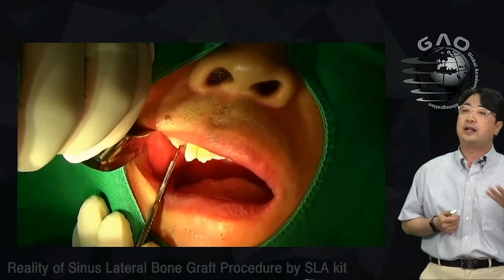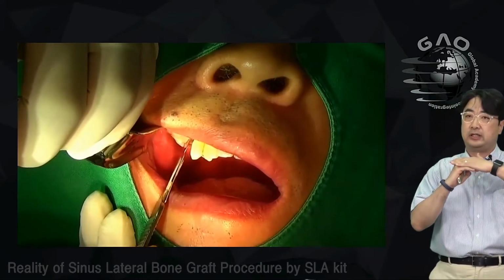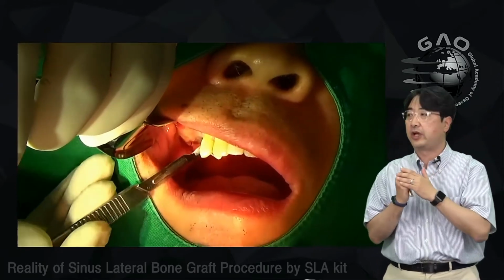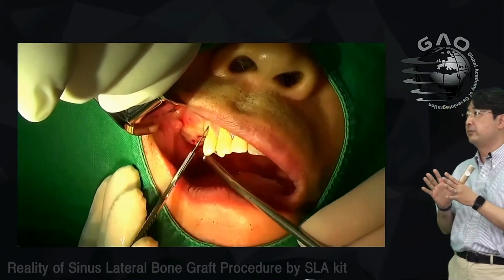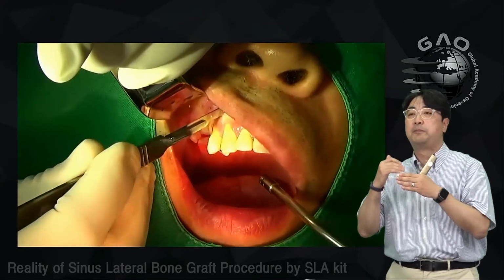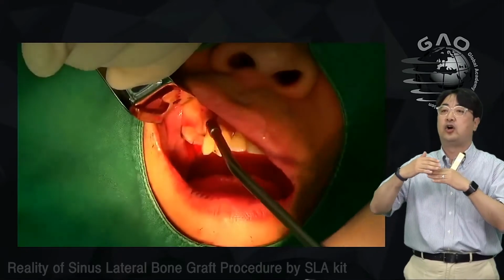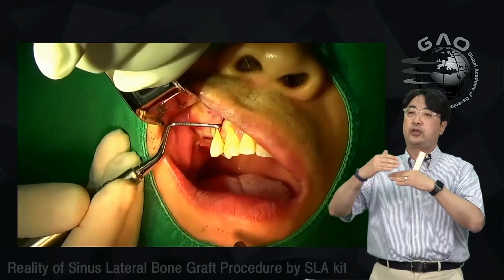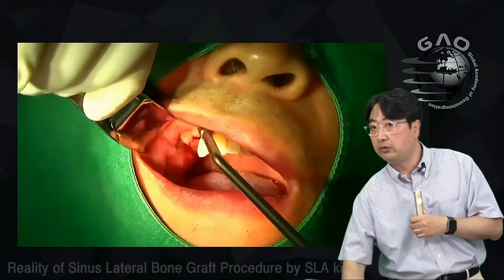My colleague didn't put anything between the maxillary sinus opening and the maxillary sinus membrane. So it means the periosteum and the sinus membrane are sticking together. So you have to dissect it, right? If you try to separate the sinus membrane and the periosteum, then you're going to have a big problem, right? You're going to have some opening, a tearing of the sinus membrane. So you have to go above. You dissect the muscle, not the periosteum. So I'm going to show you how it works.